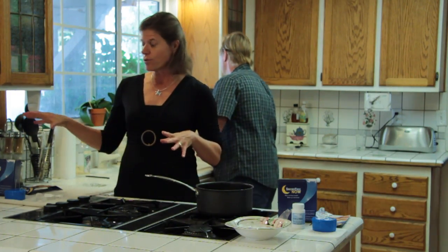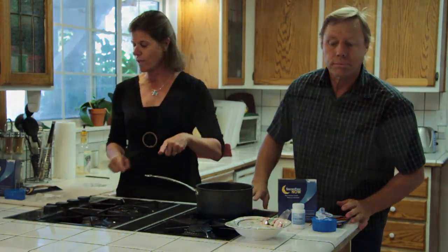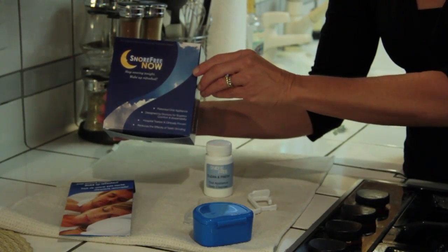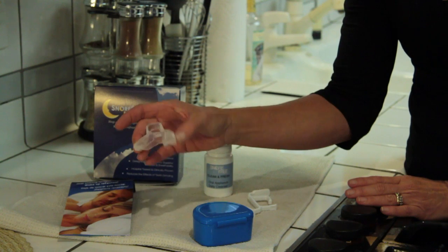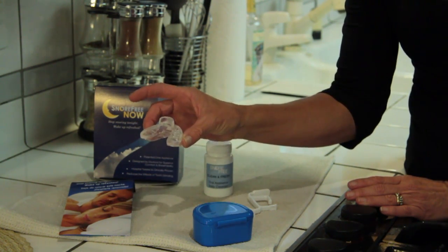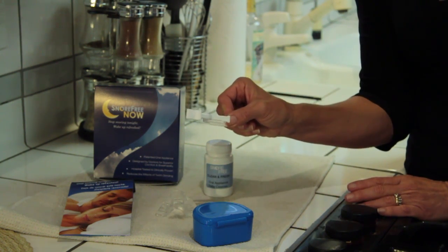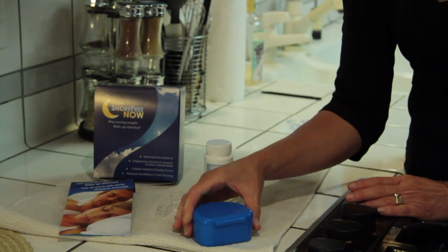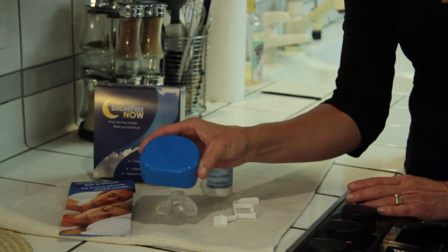We can first go through what you should have in front of you, but let's check our inventory. First thing is that you should have received the box. Number two is you should have the mouth guard. So make sure you have this in your kit, and we'll explain the anatomy to that as we move on. You should definitely have the custom little handle here. You also should have a blue dental box that you will store your mouthpiece in.